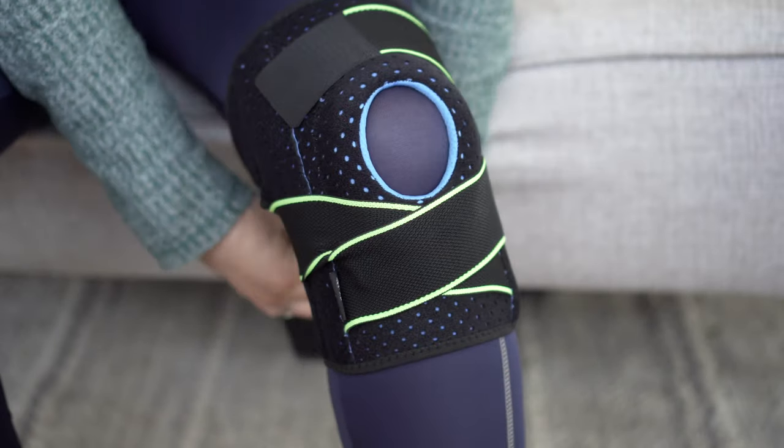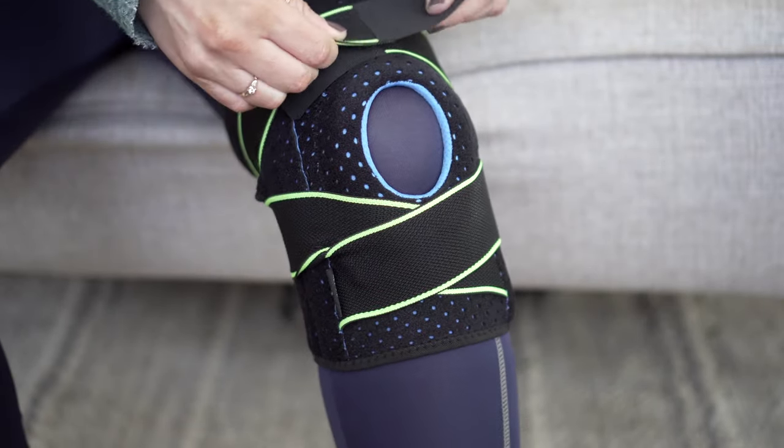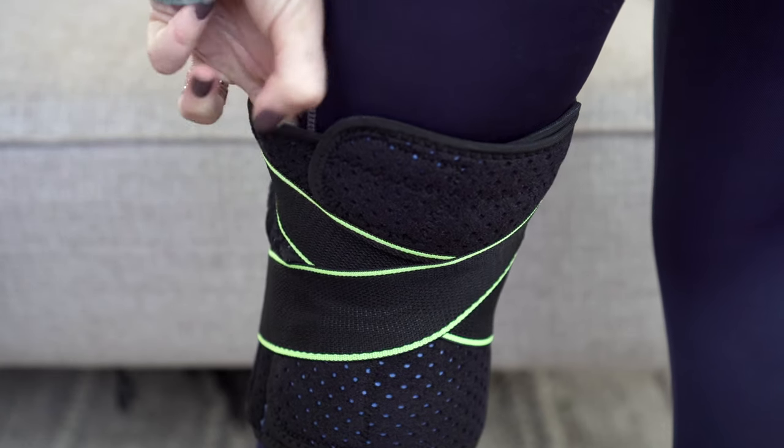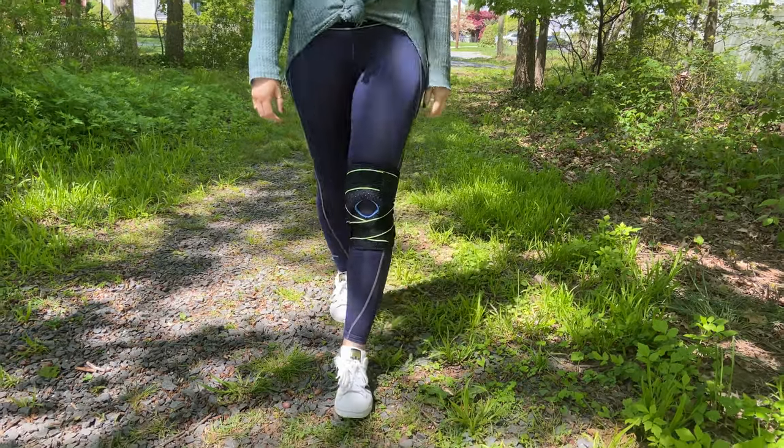To test if you are wearing the knee brace correctly, take two fingers and slide them underneath the straps. If it fits easily then you know you are wearing it correctly. If it's too tight, take the straps and readjust them. Once you have it fit the way you'd like, take a little test walk around your house or room just to make sure it feels good. If you notice that your knee brace is falling down, readjust your straps. If at any point you feel numbness or tingling, your brace is too tight and you want to readjust again. Just remember, every time you readjust, do the two-finger test.